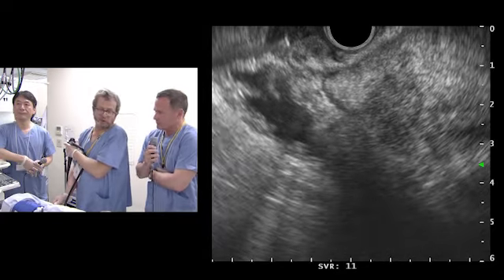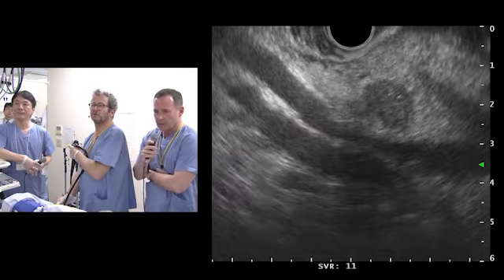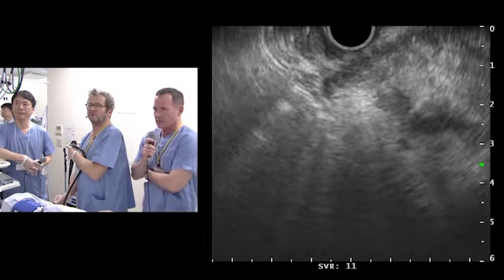We will also analyze the first pass. Absolutely. Okay, we'll see. On the gross, it didn't appear that there was much tissue, which we suspected by looking at it. But the uncinate process is a difficult place in the pancreas. It can be very difficult to access.